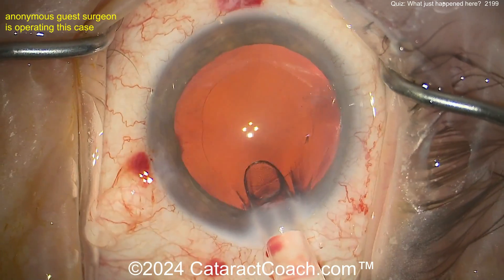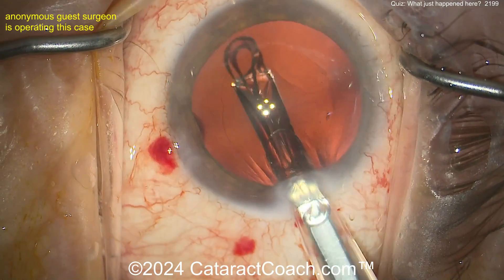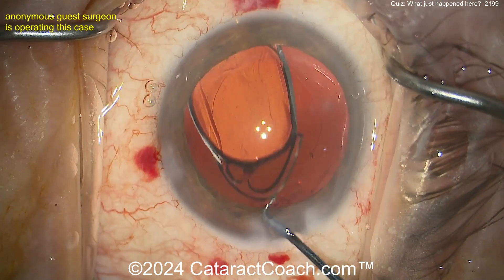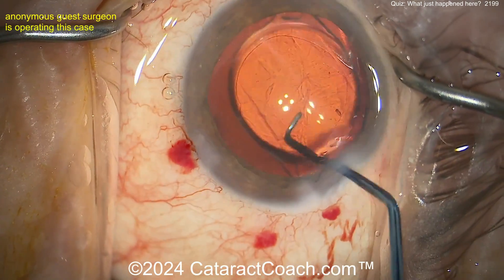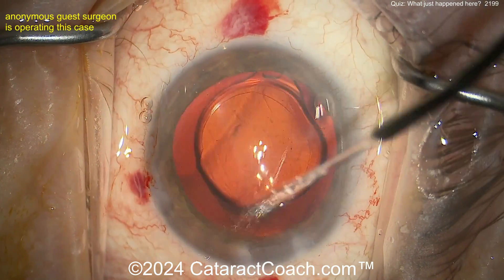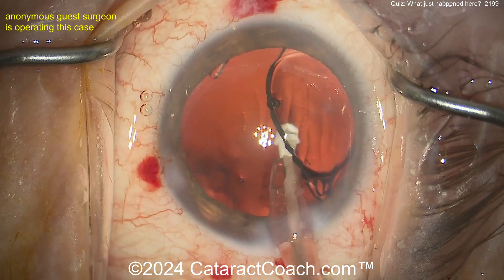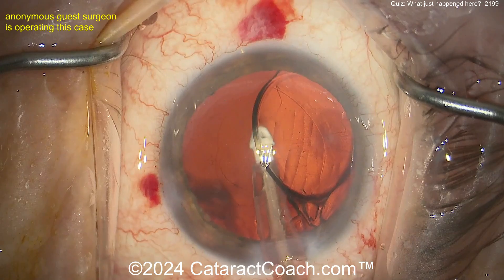The eye is full of viscoelastic — here comes the lens. Looks like a single-piece acrylic lens. Get that in the capsule bag. Now, if you are going to put this lens in the bag without a CTR, make sure you put those haptics at the area of zonular loss, so that haptic of the IOL acts as a bolster in that quadrant. In this case you do not need a CTR — you can just put this lens in. Look where that haptic is: it's exactly nasal, pushing up against the area of zonular loss.